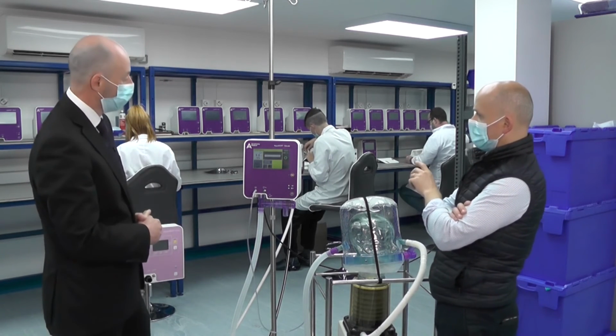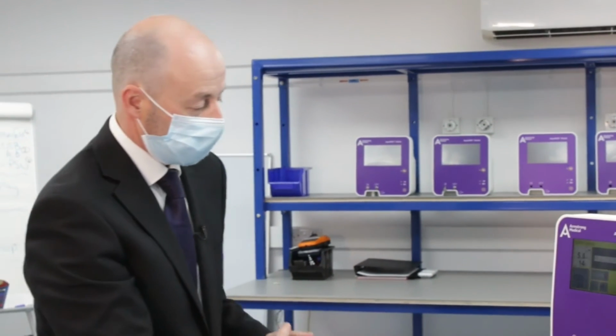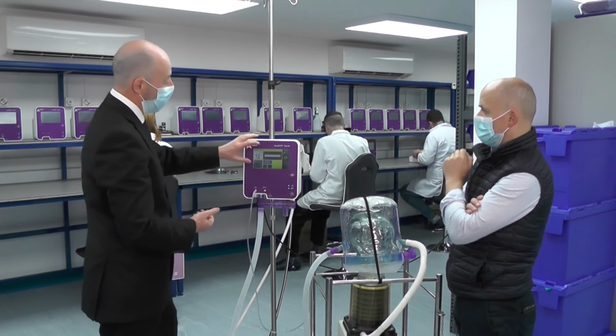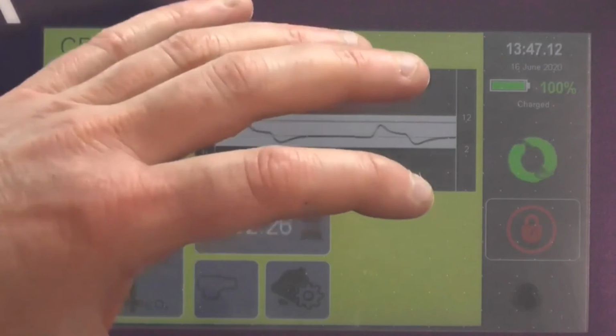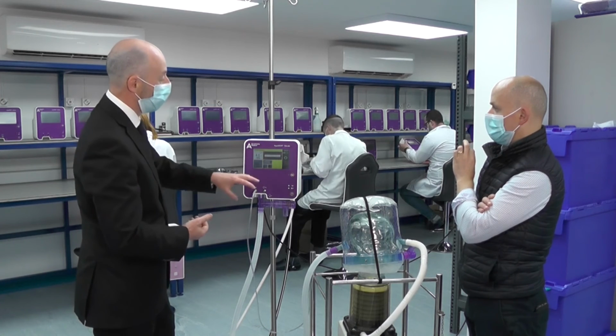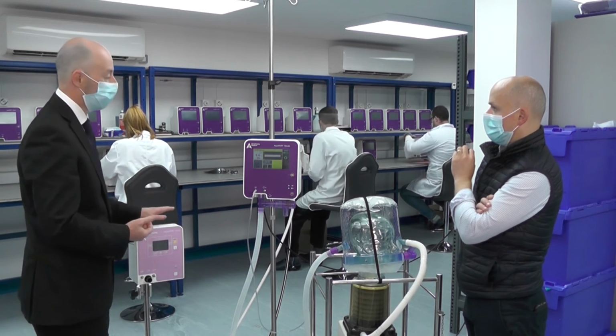And in terms of the alarm settings, is there anything additional in the alarms? The alarm system is extensive insofar as it's protecting for the use of the device during transportation. So the onboard battery is very different to the FD140. It gives you significant, incremental warnings, so that when you're using the device on transport, you have a set remaining time that is expected to last before the battery runs out, and you get prompted with warnings, something that doesn't occur with the FD140. That device depletes the battery and shuts off.